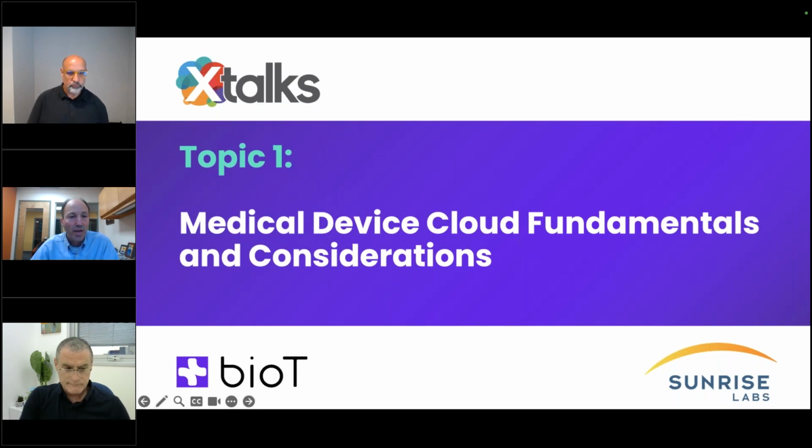On the other hand, you are making the device more complex in different ways. For example, there's a question about what should be processed on the device and what goes into the cloud. Historically, you would do everything on the device. One of the advantages of doing things on the device is that it keeps things simpler, since the device doesn't have to have as many connectivity requirements.